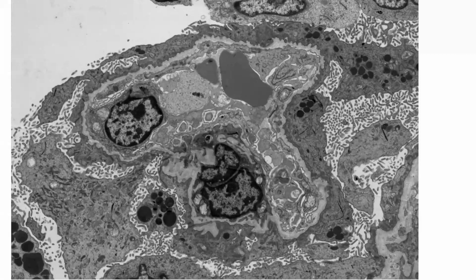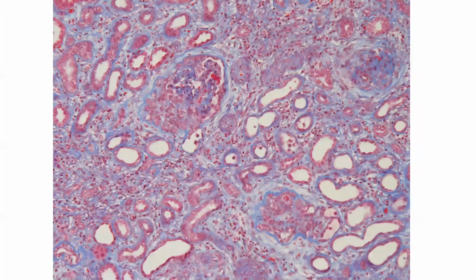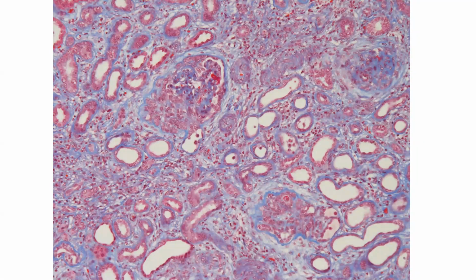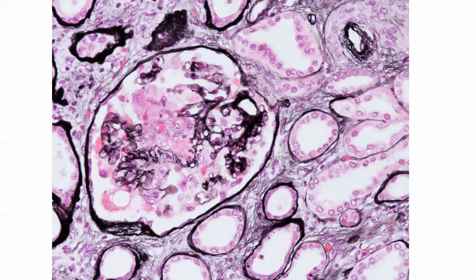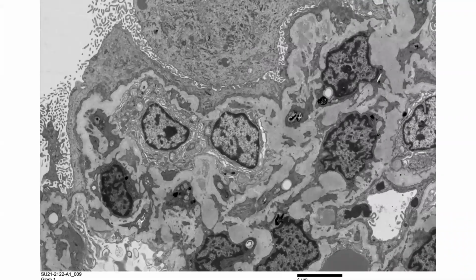Also, I mean, rarely an immune complex mediated process, secondary to probably exposure of epitopes in the glomerular basement membrane that are otherwise not exposed, causes immune complex glomerulonephritis, similar to membranous or sometimes even with mesangial deposits similar to this case. Interesting. And somewhere in the old literature, there's a study from Colombia that actually tried to make the case that Alports might even be an immune complex deposition process because they early on found a series of patients that had some electron dense deposits like this. I don't remember the details, but I remember thinking that was an extraordinary conclusion and probably quite wrong. Wow.